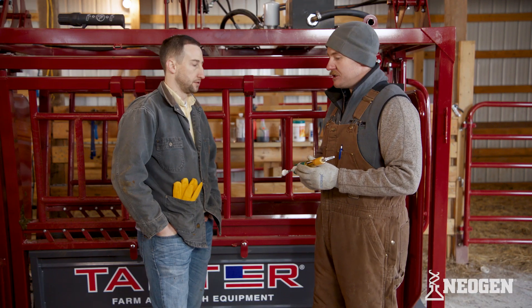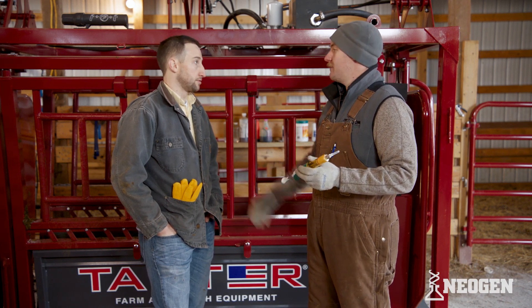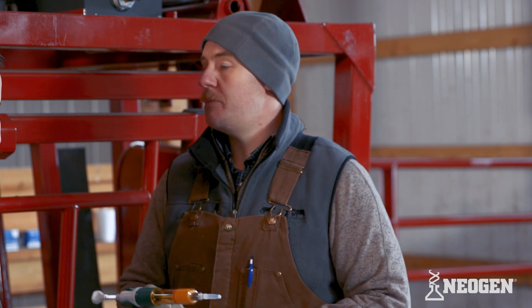Many times when we're vaccinating animals, we're giving them multiple vaccines because we want to use our time wisely and run them through the chute as little as possible. Would that be over the lifetime of this syringe — once I use it for a vaccination, it's always going to be used for vaccinations? Or after I clean it, can I switch? After you clean it, you should be able to switch and feel comfortable. As long as you clean it well, there shouldn't be any issue. Once you've cleaned it and put it back together, read the owner's manual because there's probably some lubrication you need to put in there to make sure the gun functions properly.